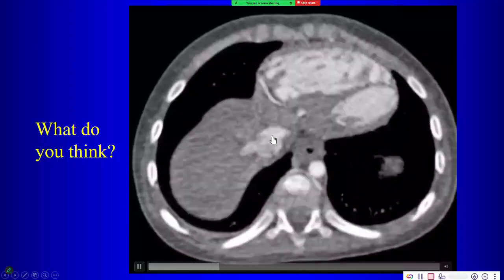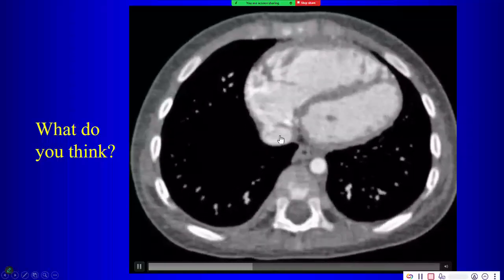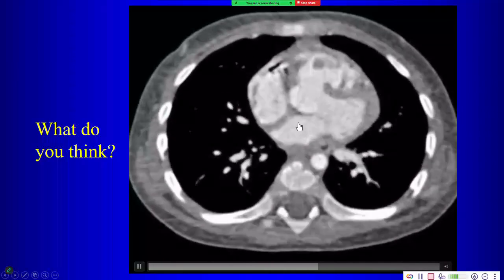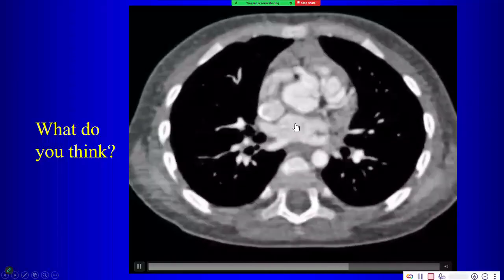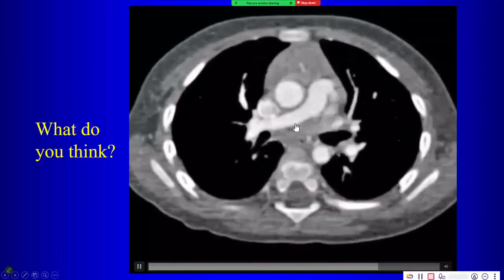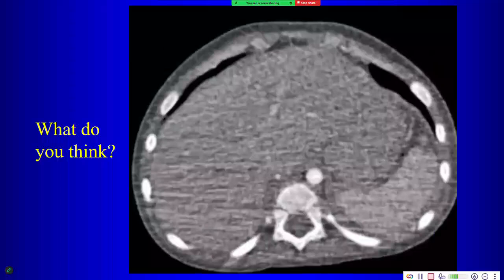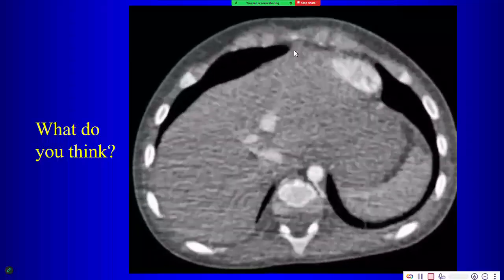So Jason, what we'd like to do is start with this guy here. What is this guy? IVC, because the IVC takes us to, and then this guy over here would be, right. So with congenital heart disease, it helps to read the studies from bottom up. So the first thing you want to identify, IVC, right atrium, left atrium.